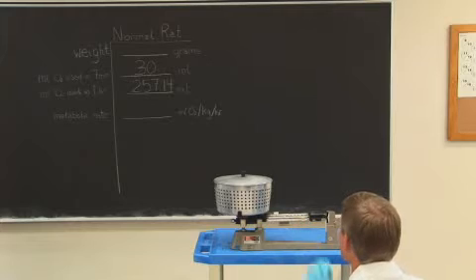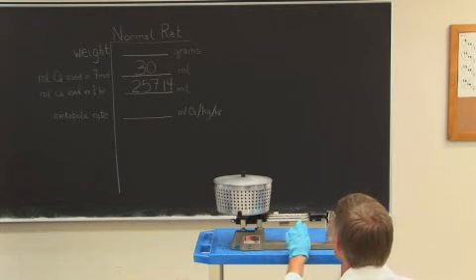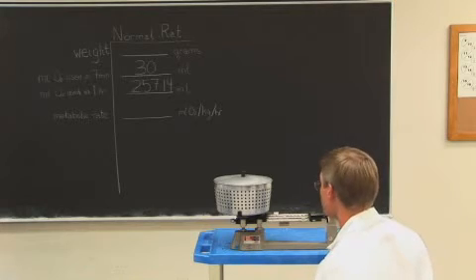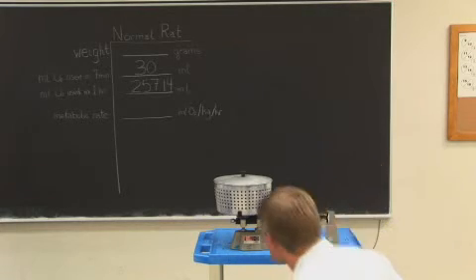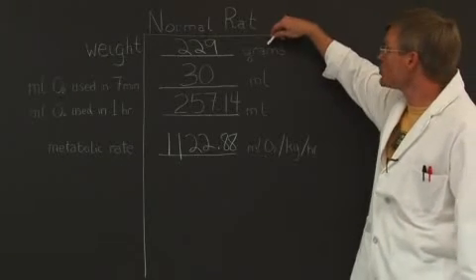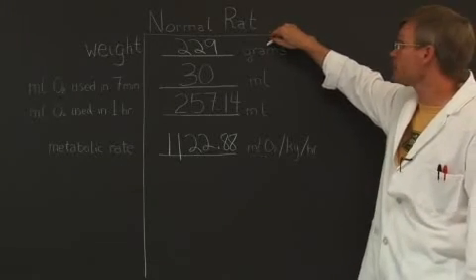So this rat weighs approximately 229 grams. We determined that the weight of the rat was 229 grams.